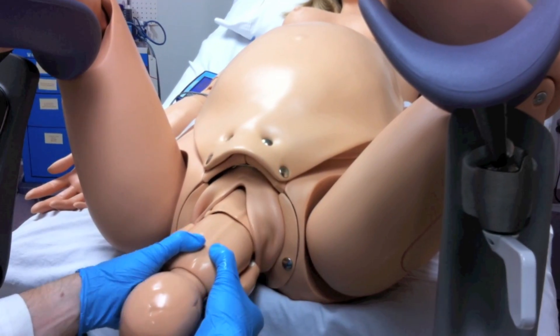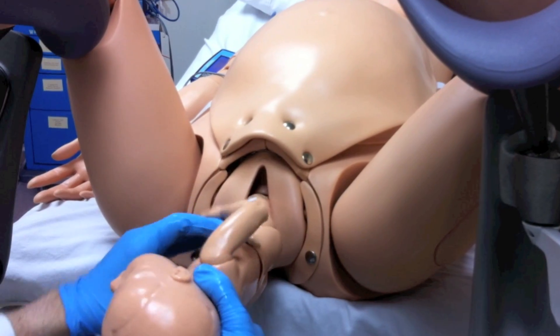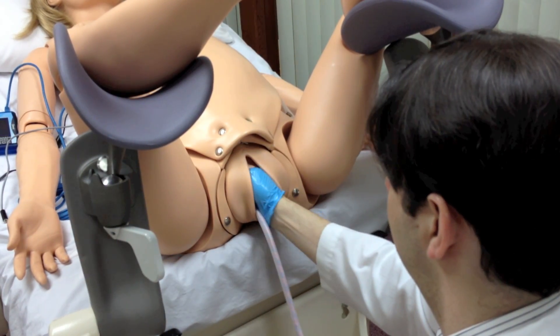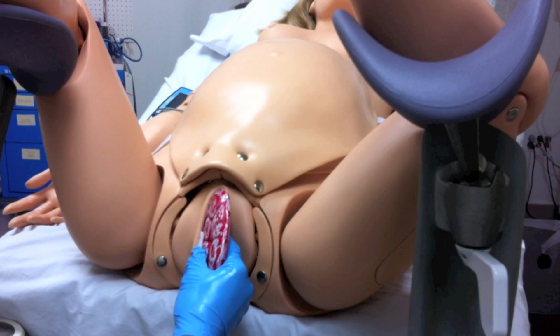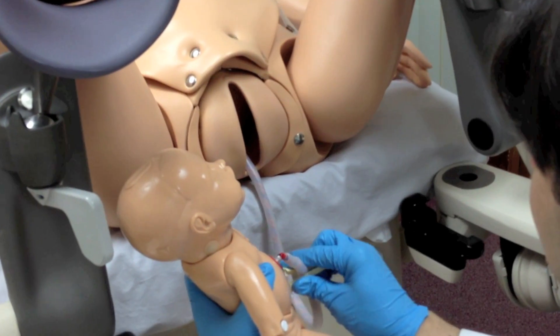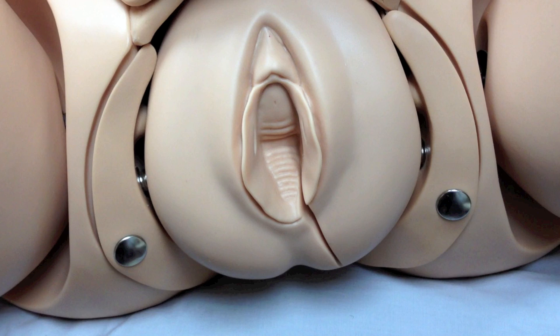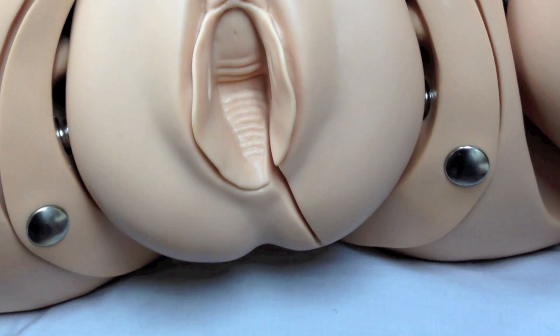When the shoulders are completely delivered, the motor turns off. The students should then remove the fetus from NOEL in a normal fashion and proceed to birth a placenta. The umbilical cord can be clamped and cut. Students can also practice episiotomy repair.